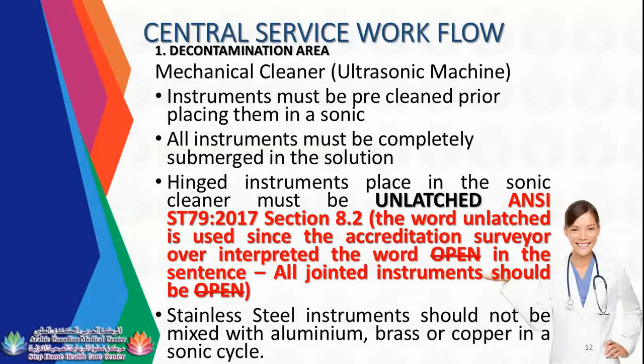Stainless steel instruments should not be mixed with aluminum, brass, or copper in a cycle. There are chemical reactions with different types of metals. So once you mix aluminum and other metals, you can see some reaction on the instruments. They become darkened.